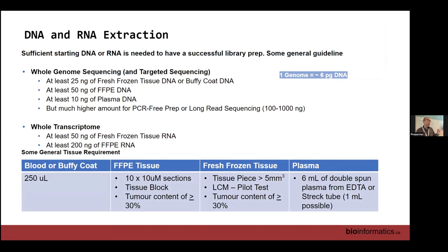We noticed that thinner slides may not work as well. A lot of the time, a thinner slide may actually cause a bit more degradation for some unknown reason. Actually, this is just more an observation. I really don't have a way to explain that.